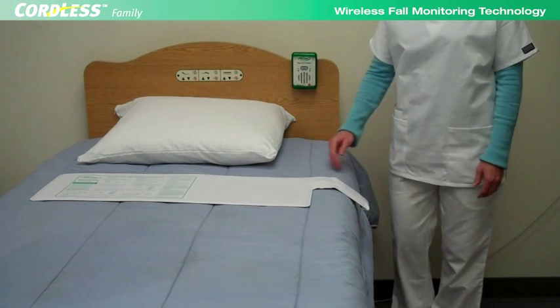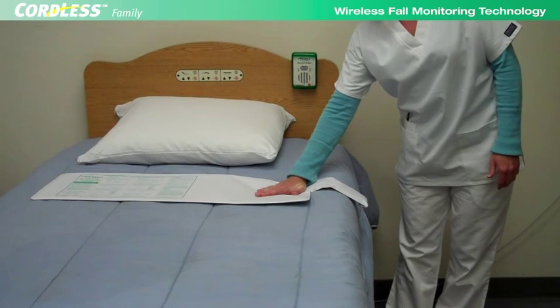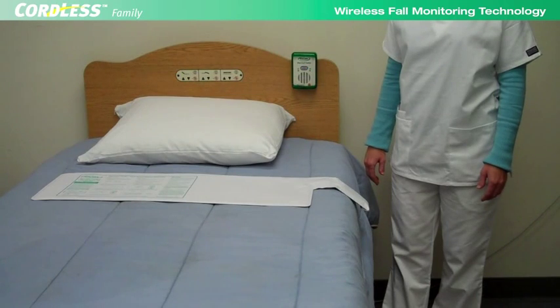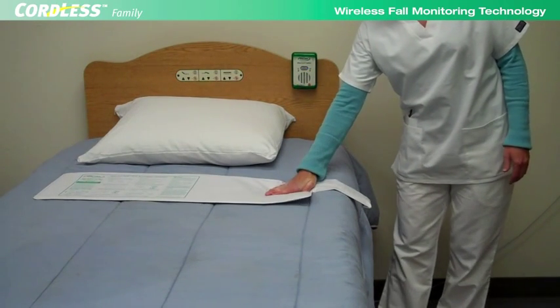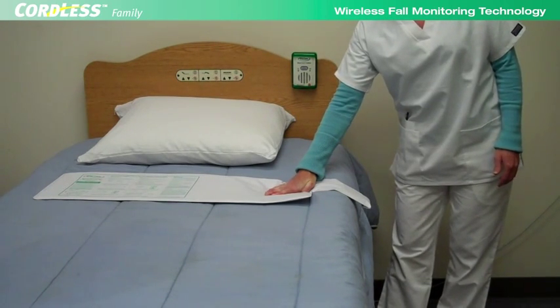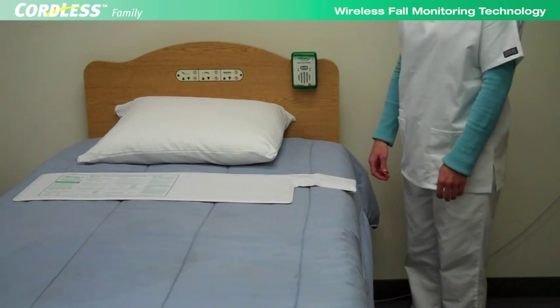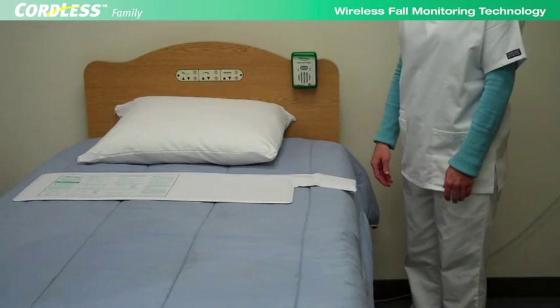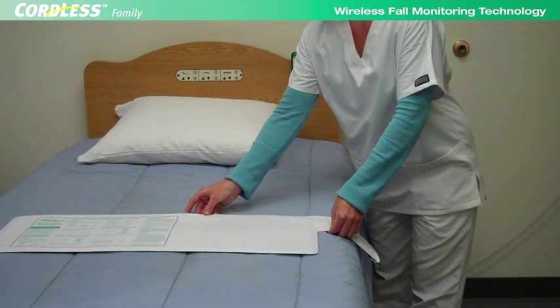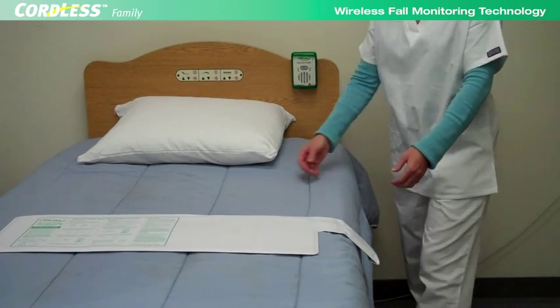Place pressure on the sensor pad, then release the pressure. When notified that the resident is getting up off the bed, position the pad lower on the bed under the resident's buttocks.